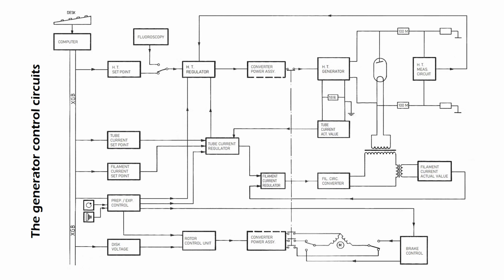The high tension is measured, the value measured is compared with the set point issued by the computer, and the difference signal is the controlled variable, with which the repetition frequency is varied. In this way, the high tension is varied or kept constant. The above procedures and control actions for current and voltage at the tube have much in common with those of the other make and models of high-frequency generators.